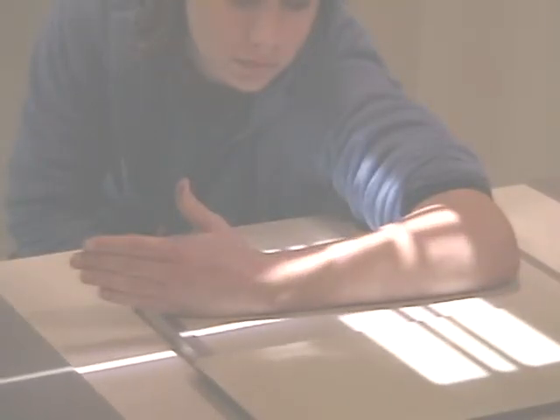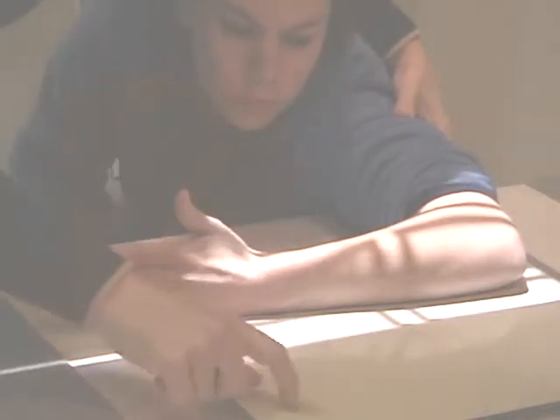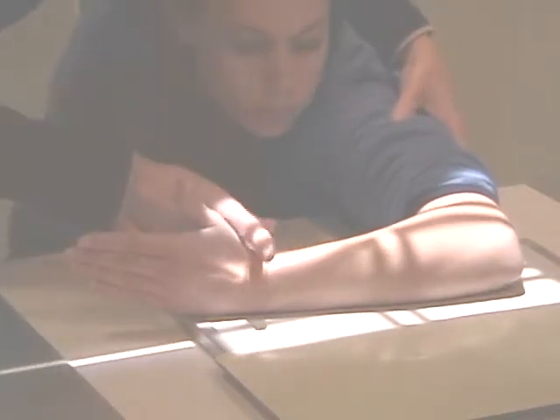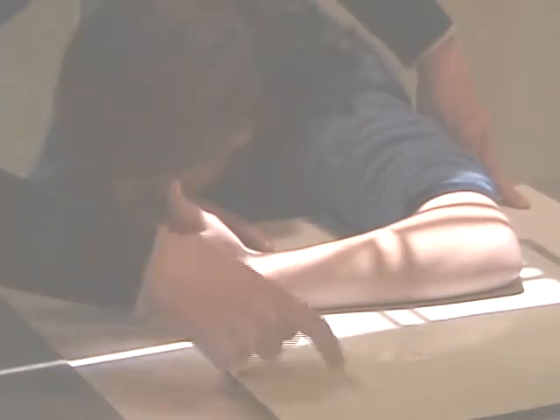And again, you try to hurry. These are not comfortable positions to hold. And I'm realigning my setup here. I got it close. Now I'm going to focus on her. Here's the carpal bones. I want them the same level as my very first one. So here's my carpal bones, and if you remember, they were 1.5 inches from film's edge. So I'm just going to have her lift her arm up, and I'm going to slide the cassette. There we go. There's the carpal bones, 1.5 inches from the edge of the film. Then I will have them at the same level, and I will not have the stair stepping.